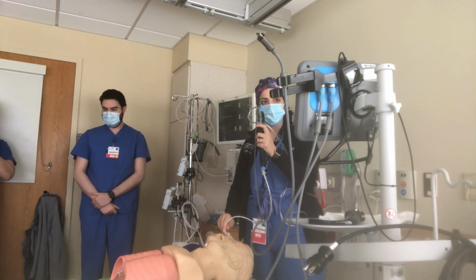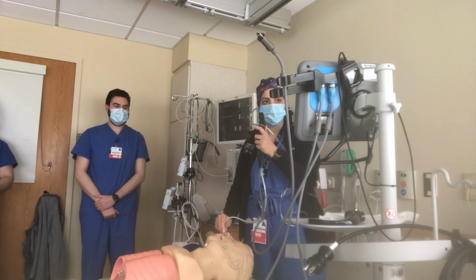It does smell like a cough drop. It's a hurricane spray. Yeah. Honestly, this is really cool, kinda nice.